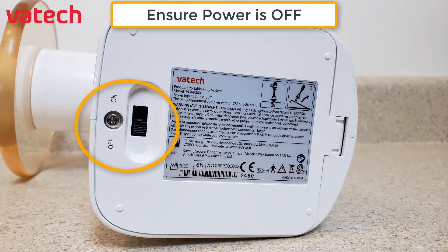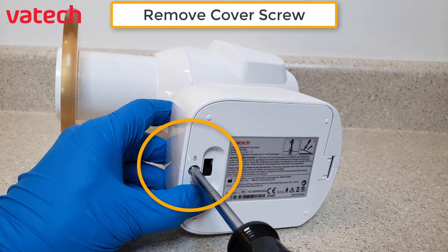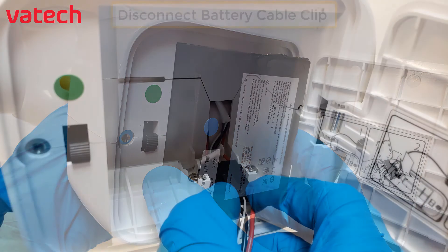First step, ensure the power is off. Next, remove the cover screw with the Phillips screwdriver. Tilt the EasyRay Air Portable to slide the battery out.